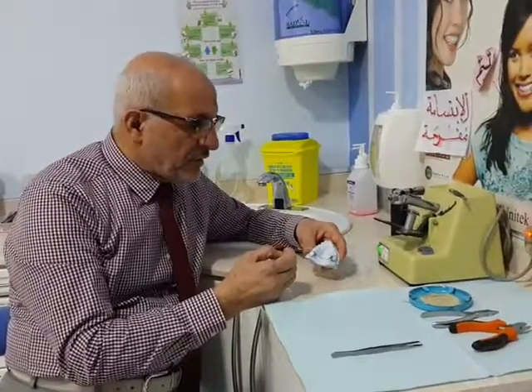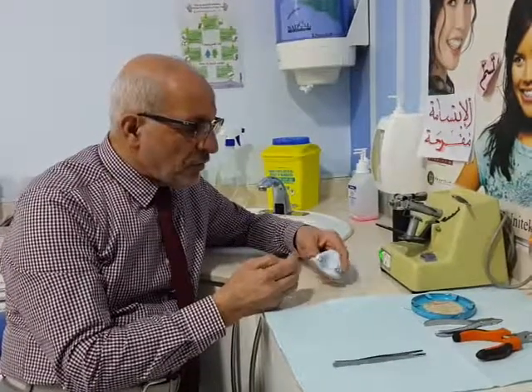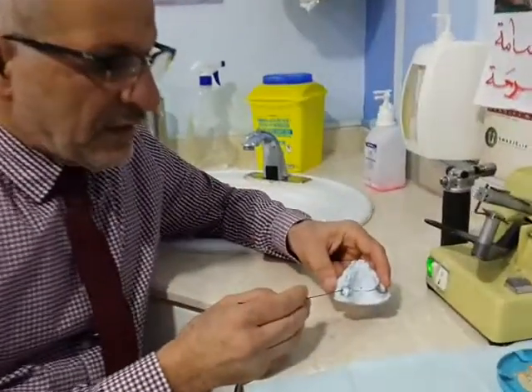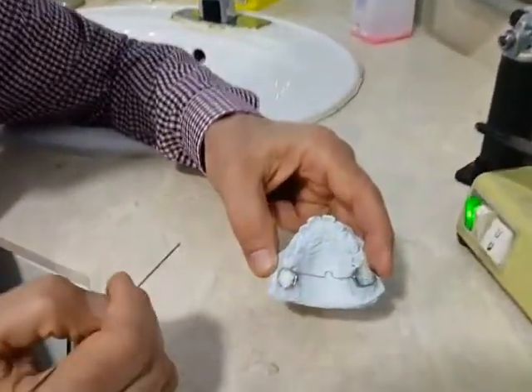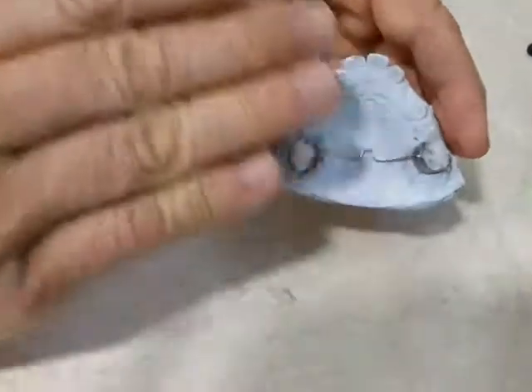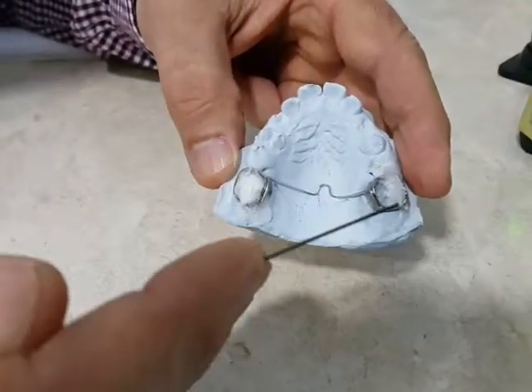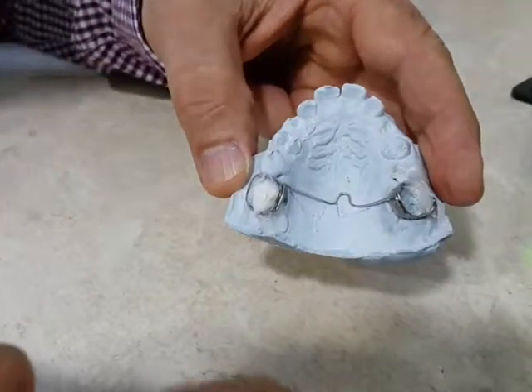The construction of this appliance consists of the following procedure. First of all, we select the band and fit them on the molar teeth, right and left. The second procedure is to take an impression, and then we remove the band and insert them in the impression material.